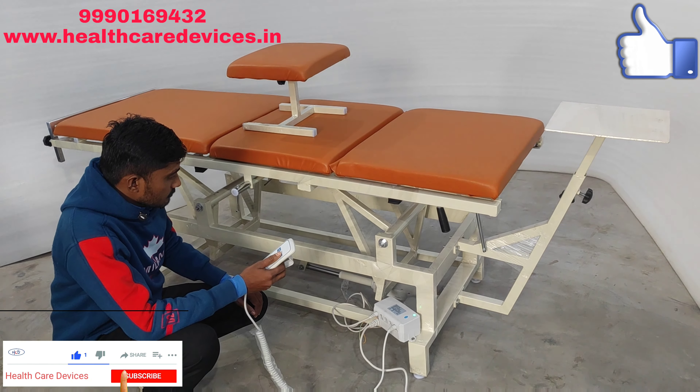So we will stop this here. Friends, this was a small demo — high-low with 3-fold bed. The demo is complete. Thank you.